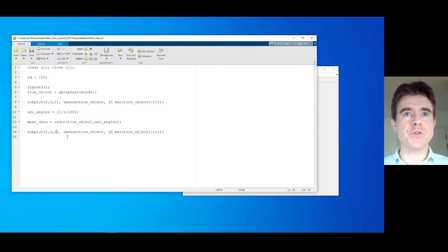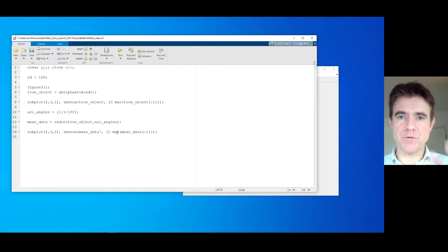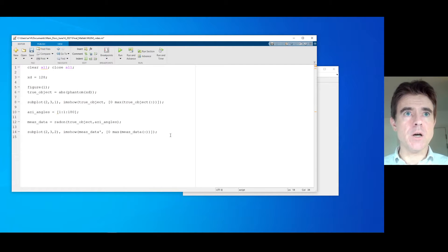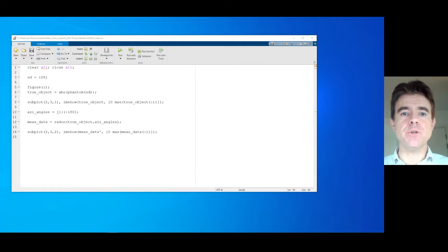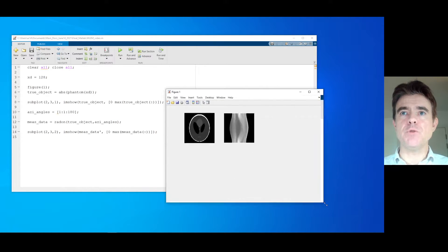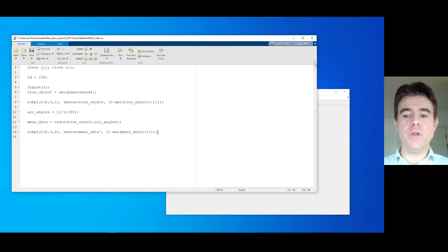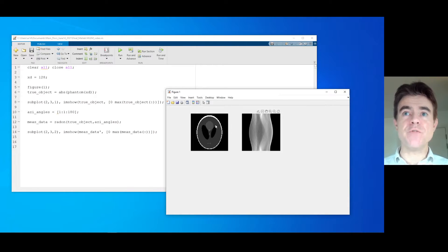Let's check that this is working. I'm going to display that measured sinogram — the measured data — in the transpose, because I prefer to have the azimuthal viewing angles going vertically. I've now got a figure which shows the true object and the sinogram. The goal then is going to be to reconstruct that object from that sinogram.